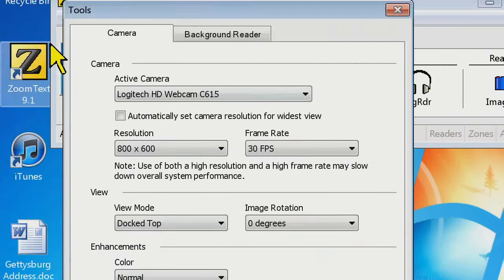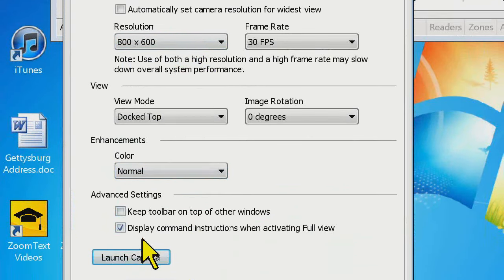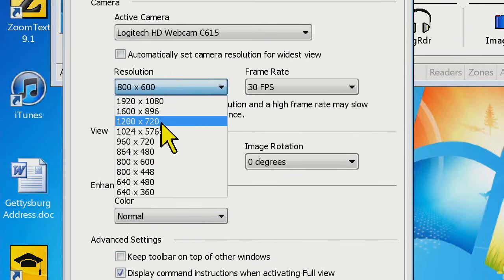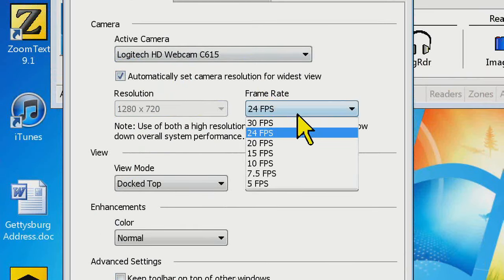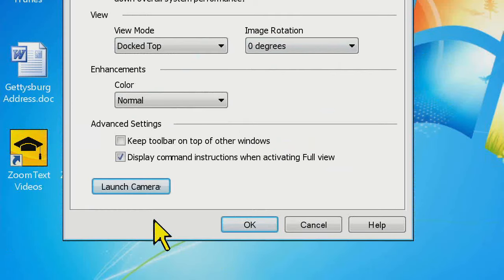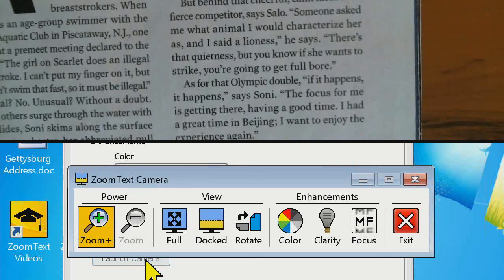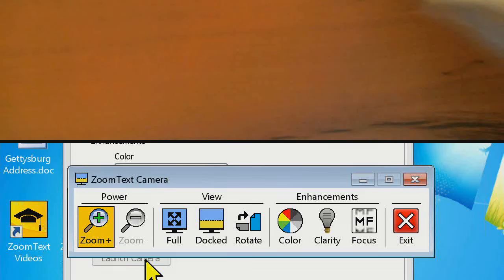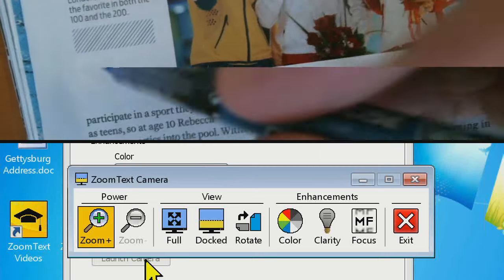Okay. If you could just talk a little bit about how that's useful for handwriting. A lot of people use this feature to sign checks or to fill out a form, and maybe if you can explain what you might want to set it at if you're trying to sign something. Yeah, so Camera horizontal split, again, along with these frame per second settings, if I was looking to sign something, okay, I'm just going to write in this magazine, I don't really care here.